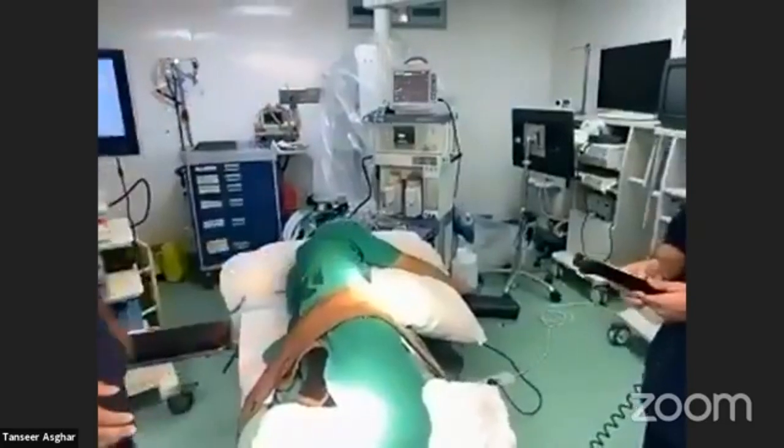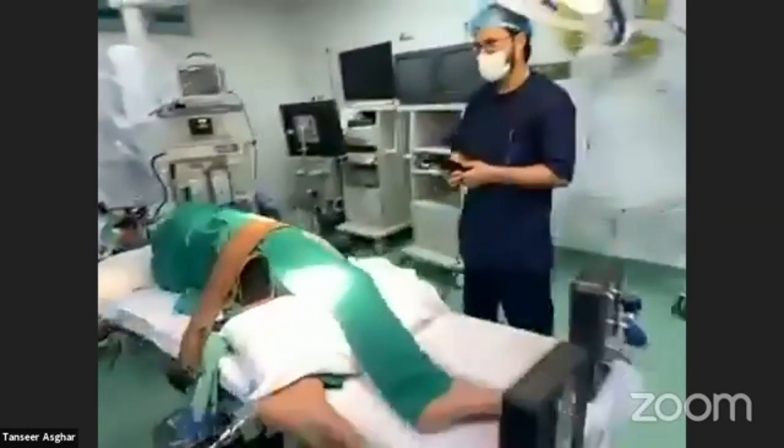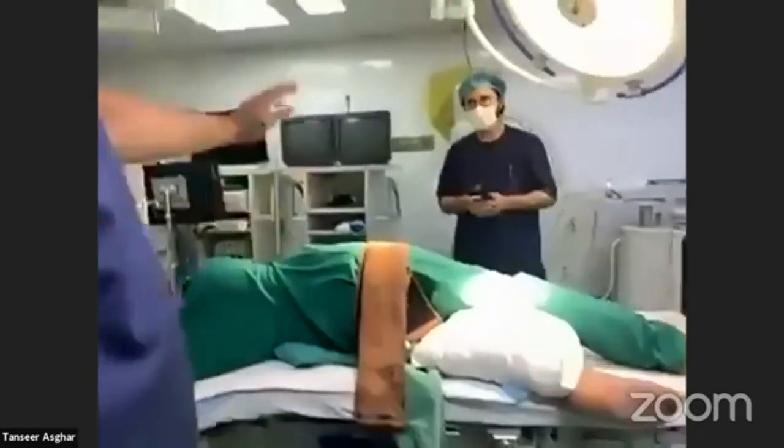In the lateral position, we break the table in the middle so that the kidney area becomes more prominent and accessible.